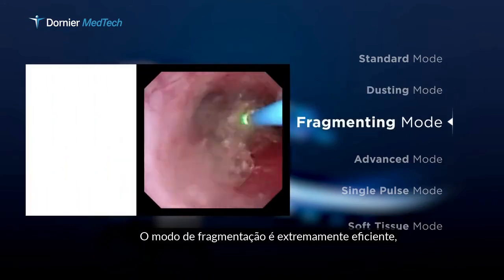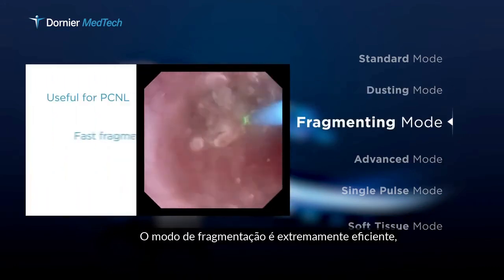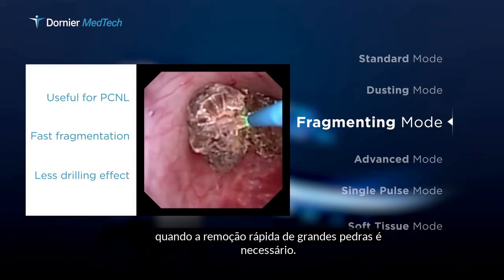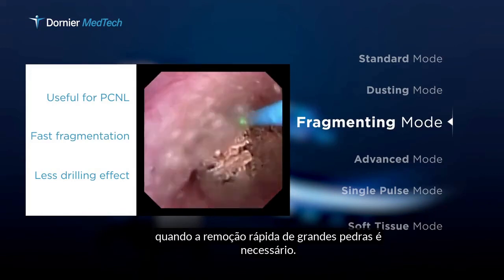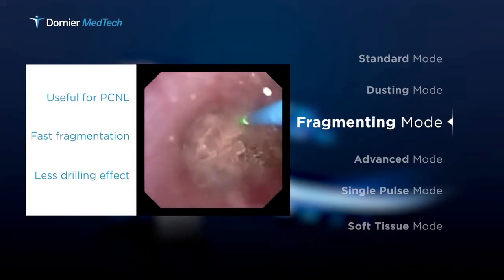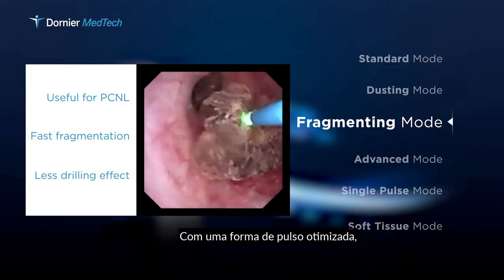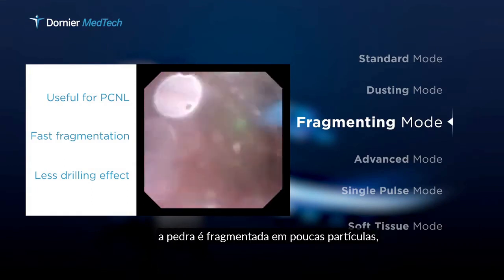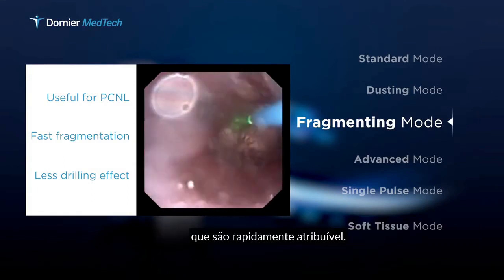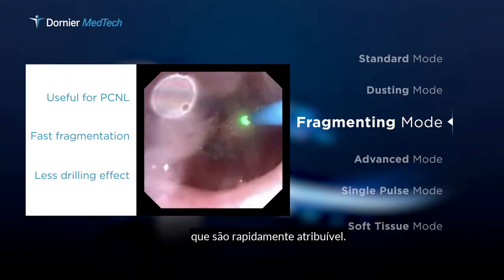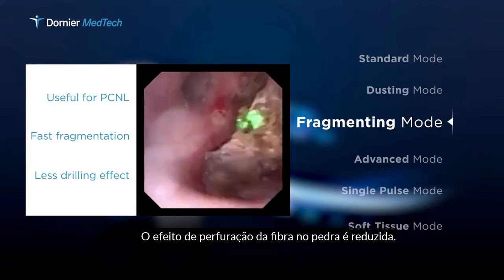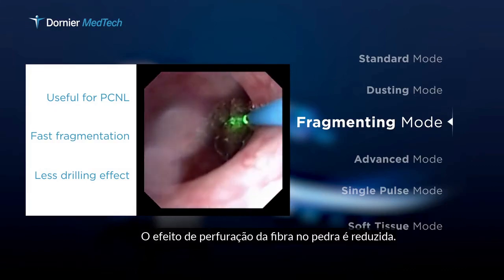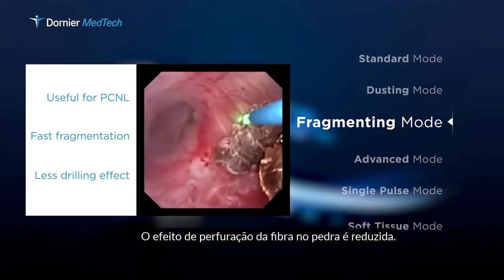The fragmenting mode is extremely efficient when fast removal of large stones is required. With an optimized pulse shape, the stone is fragmented into few particles which are quickly retrievable. In addition, the drilling effect of the fiber into the stone is reduced.